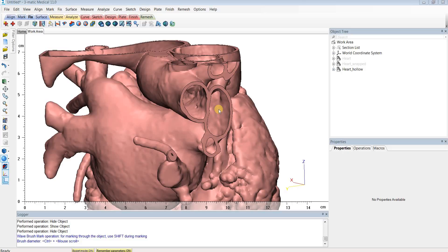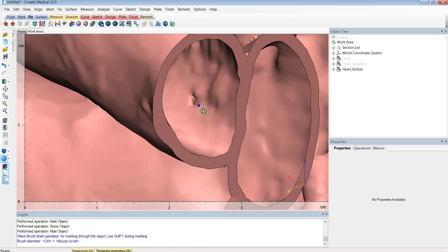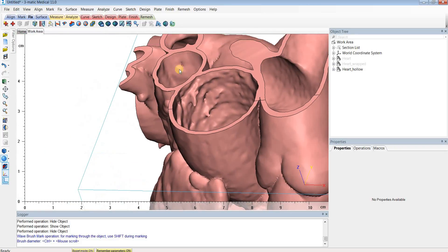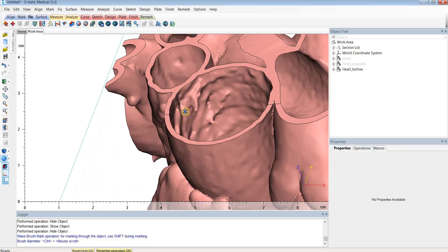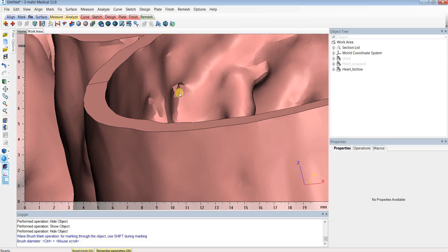A common problem in hallowed models is holes or connections that shouldn't exist. Here you can see an example with small holes between the pulmonary artery and pulmonary veins, as well as holes between the SVC and the aorta. In reality, these holes aren't present in this patient, and we'd like a model that's true to the patient's anatomy, so these should be fixed.